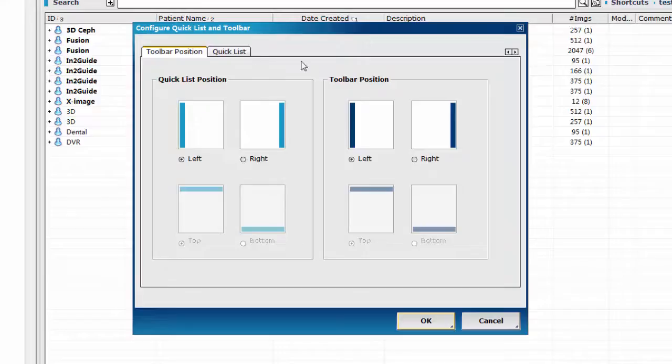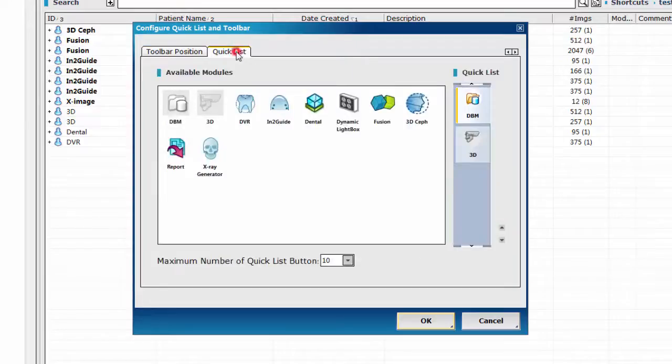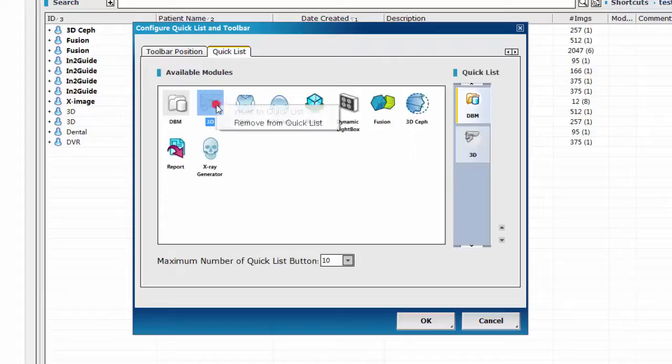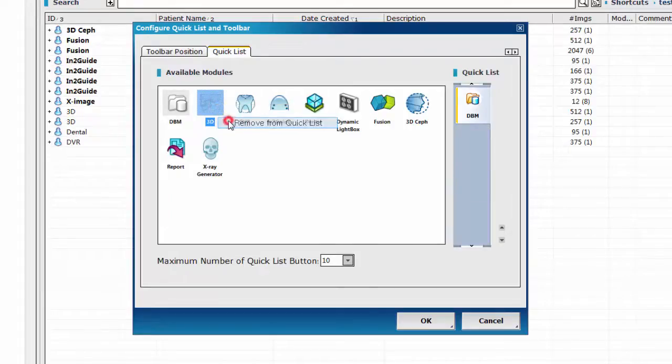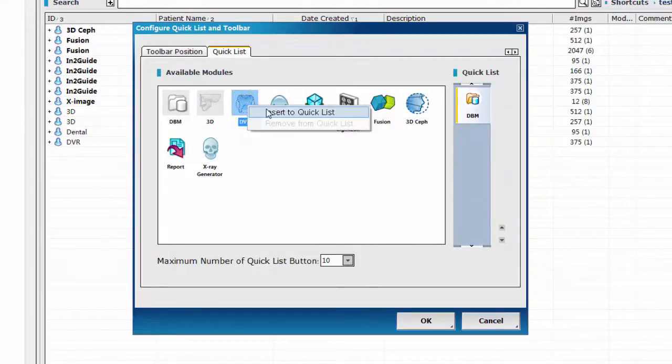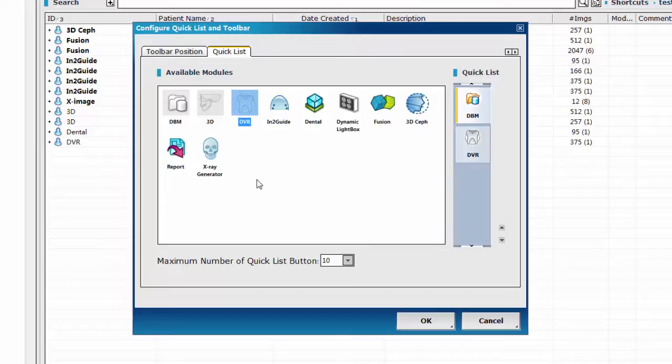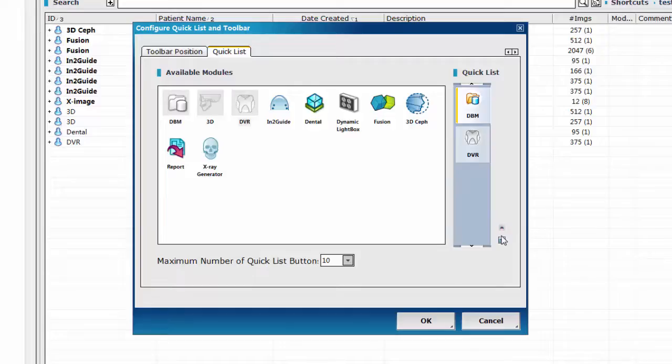In the quicklist tab, you can click on the module icon and select remove from quicklist to remove or insert to quicklist to add. Use the up and down arrows to move the module's positions.